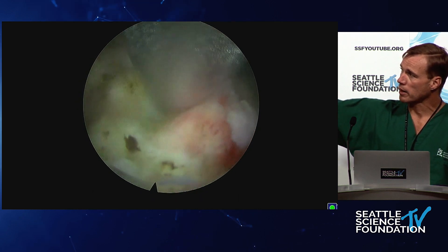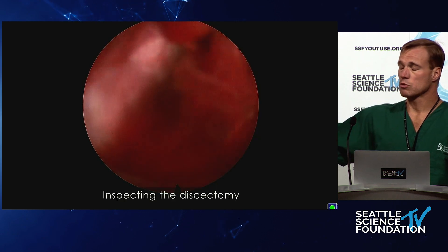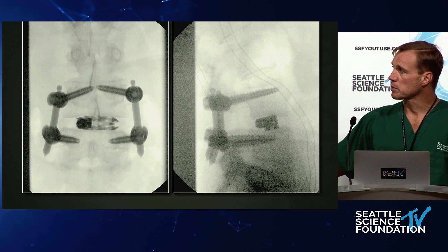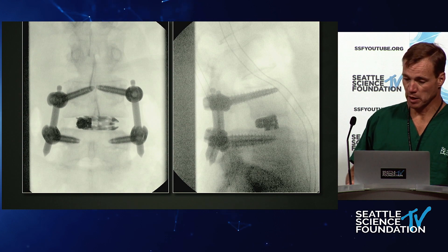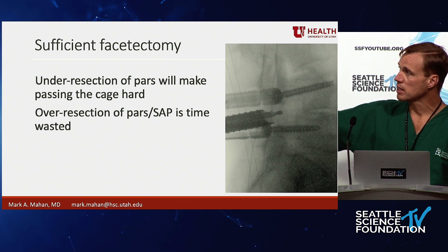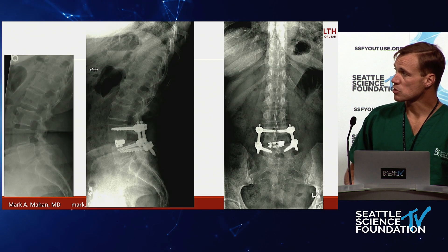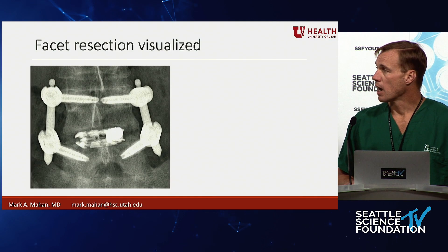I sweep the traversing nerve root away and proceed aggressively with the discectomy. I can see the superior aspect of L5. I put a wire into the disc space and impact it until I feel the anterior annulus stop, then complete the discectomy under fluoroscopic imaging. I come back to inspect the end plates and then pack in a large expandable cage — typically 10.5mm wide and 31 or 36mm long. For spondylolisthesis, key steps include resecting the PARS high enough to give visualization and reaching the contralateral SAP.